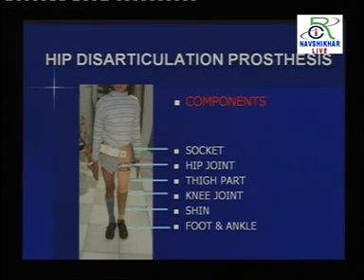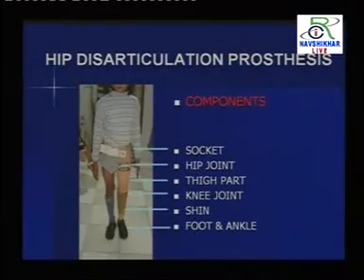आराम से इसके बाकी का पार्ट जो है, एंड इट गिव्स ऑल द प्रोविज़न। सिटिंग का प्रोविज़न है, चेयर पे बैठ सकते हैं, ज़मीन पे नहीं बैठेंगी, चेयर पे बैठ सकती हैं विद द फ्लेक्शन ऑफ द हिप एज वेल एज फ्लेक्शन ऑफ द नी, दोनों फ्लेक्स करके ये चेयर पे आराम से बैठ सकती हैं। एंड दिस इज़ द थिंग विच इज़ वेरी लाइट इन वेट। आप कवर देख रहे हैं, फोम कवर है, इसके अंदर पूरा मेटल का बना हुआ है, जो वेट बेरिंग एरिया है दैट इज़ द मेटल. That is also known as endoskeletal design.